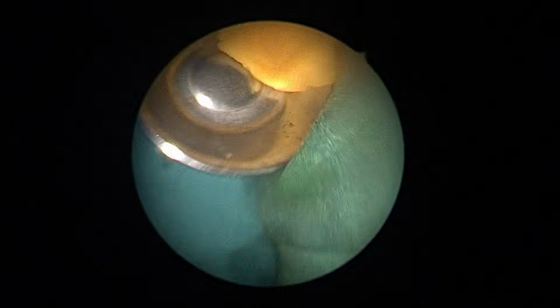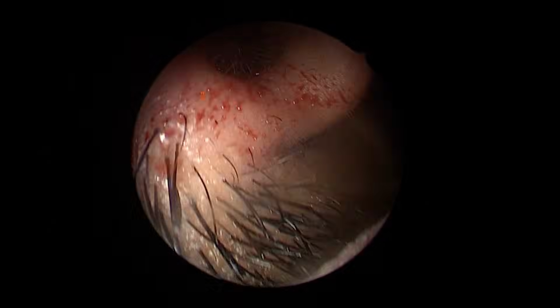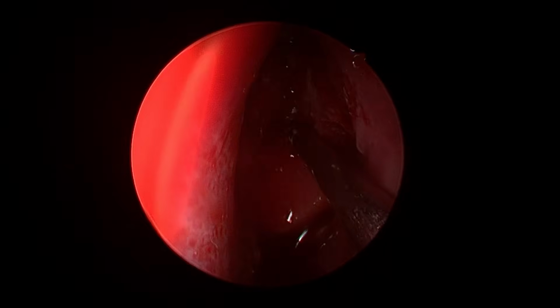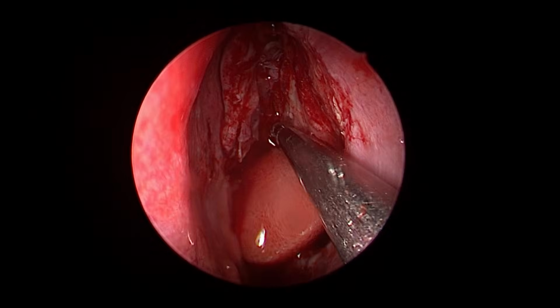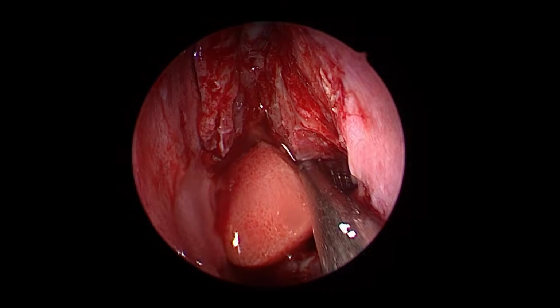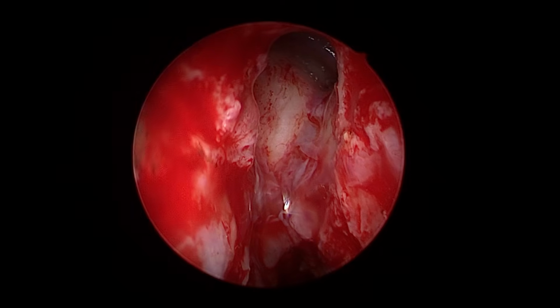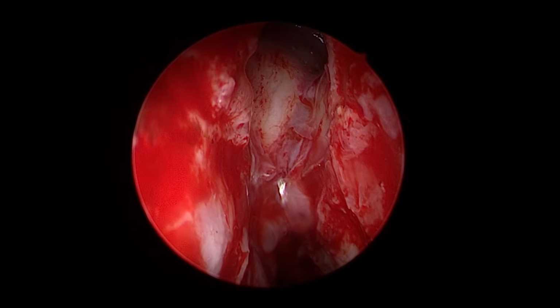See now, my criterion of adequate frontal sinus opening, for assessing whether the irrigation will reach adequately or not, is visualization of the frontal sinus with a 0 degree scope. See this. If you are able to see the interior of the frontal sinus with 0 degree, can you see? Yes, excellent.